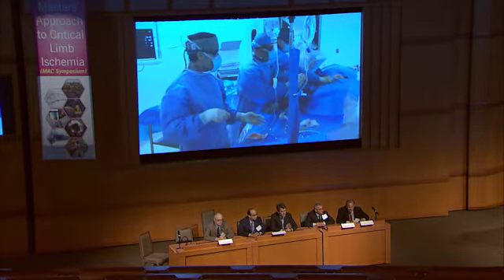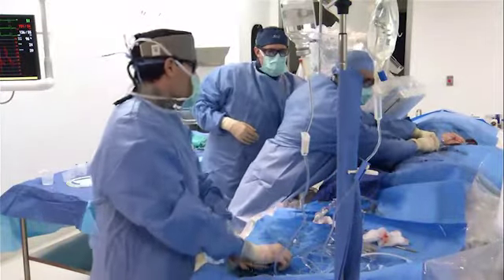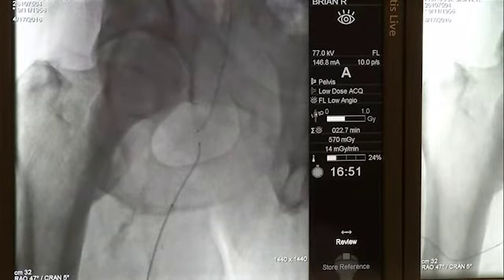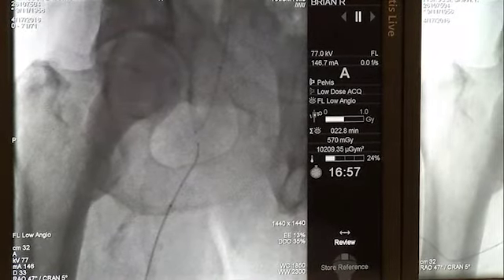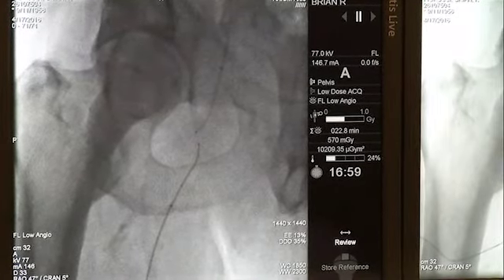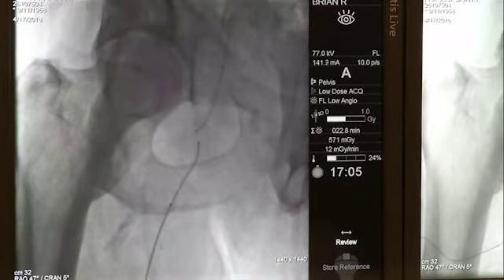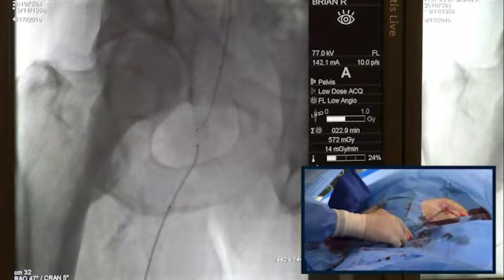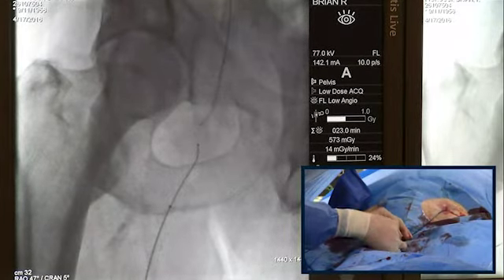So what's the issue here is that now if you're uncomfortable, in my opinion, what you can do is that you can come now from the top. At least you have a landing area. So now we can bring this from the top. Take this wire up. So if, let's say you're uncomfortable and you're not sure you're going to compromise the profunda, you want to be kind of more confident about your decision making. So one of the techniques you can use is that now that we have a marker there, so turn the Navicross toward this, yeah, and then come down here. Turn it. So you can use the Navicross to turn it.